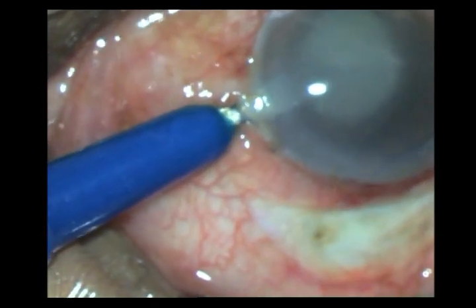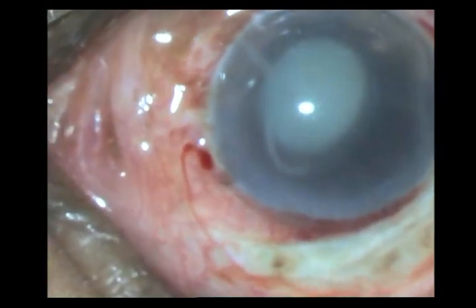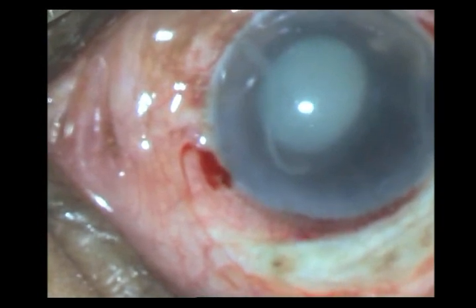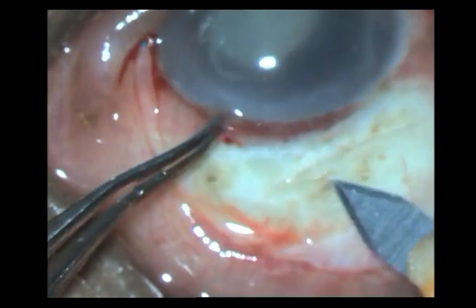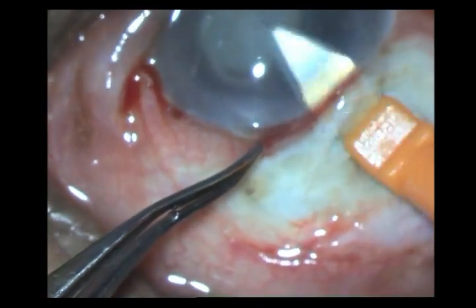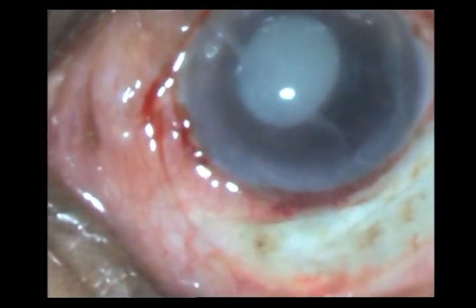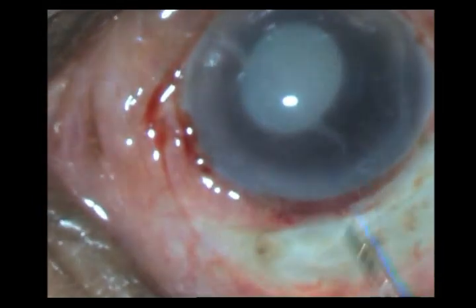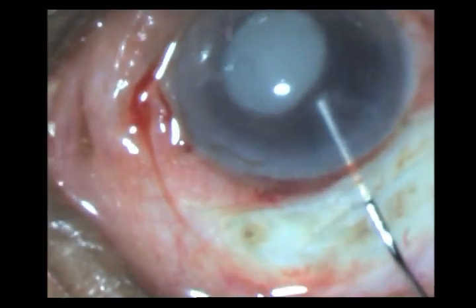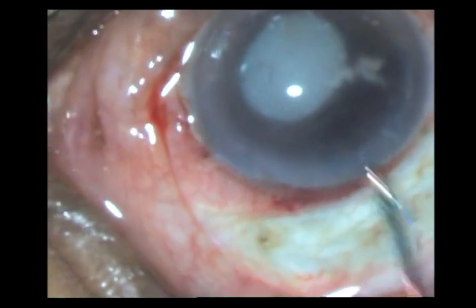Once I have done my side-ports, I enter into the anterior chamber with the keratome, and at this point I am not going to enlarge the incision — I just enter and come out. I then take a hydrodissection syringe and wash out the AC, trying to wash out these exudative membranes and exudates from the anterior chamber to give me better visualization.